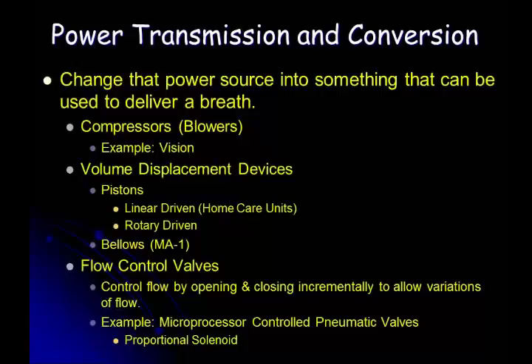Sometimes the mechanism is a piston. As you can imagine, if I push a piston forward in a fixed space cylinder, I'm going to create a positive pressure there, which will then displace gas into the patient.